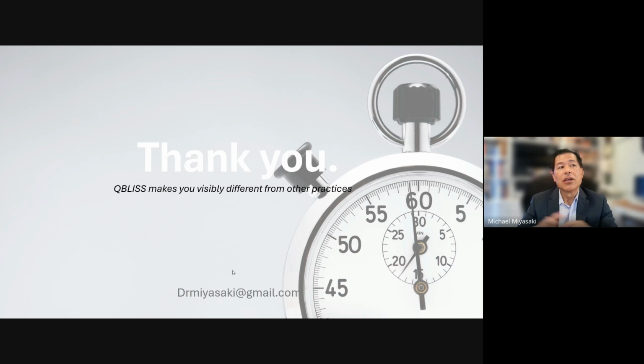You know, those are the patients you walk by when you're in a crowd and you smell the periodontal disease, right? And so we need to treat that and help the patient understand what the cause is. And again, I think both the intraoral camera, but that red color that we see is so important, because in that patient, that's a periodontal patient with the halitosis, when we go through the camera, like I didn't show images, but you'll go through the mouth and the gums will just glow everywhere, especially on the lingual side of the mouth.